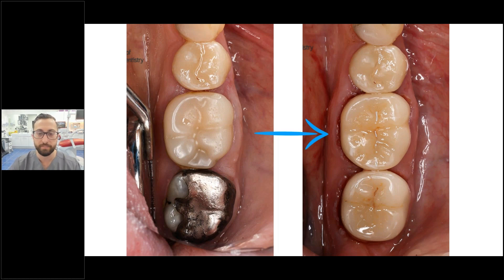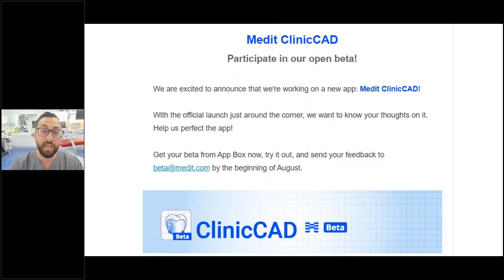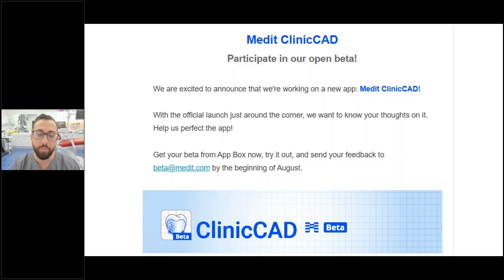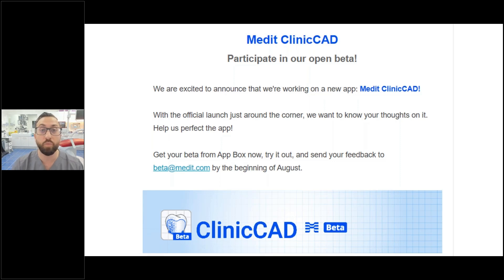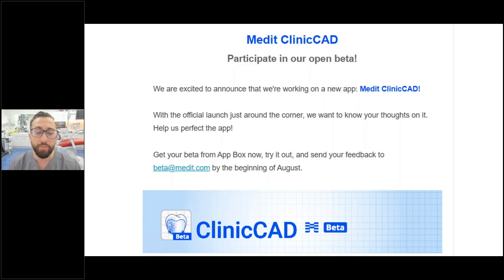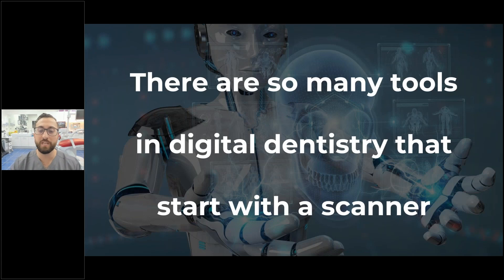Medit Clinic CAD is in open beta at the moment, but it's a really interesting app — basically their foray into full CAD/CAM. They have a scanner and now a proper CAD software, which makes this space really interesting. The app can be downloaded by anyone, it's in the App Box, and it's free. I'll be very curious to see how the company develops it.